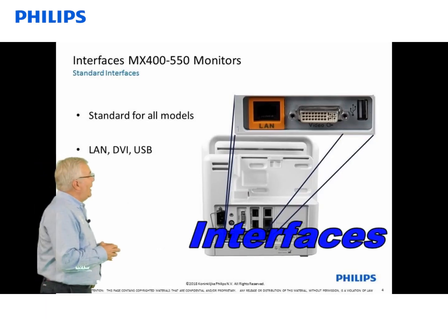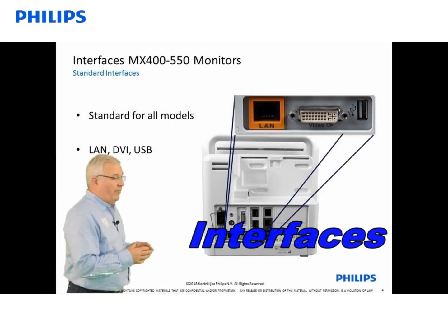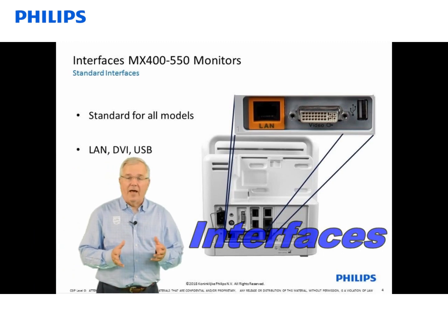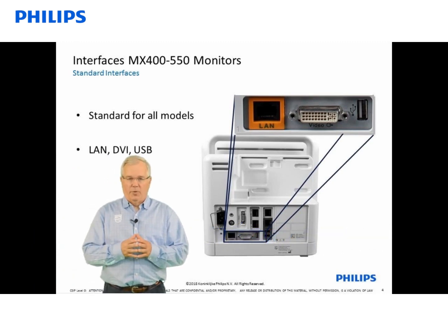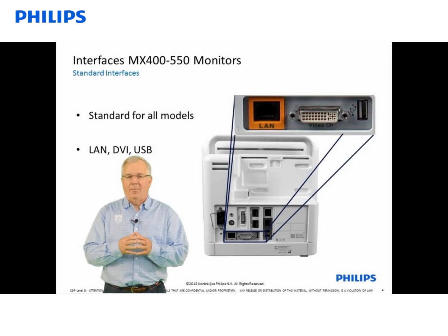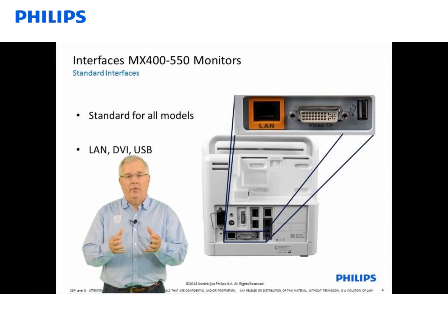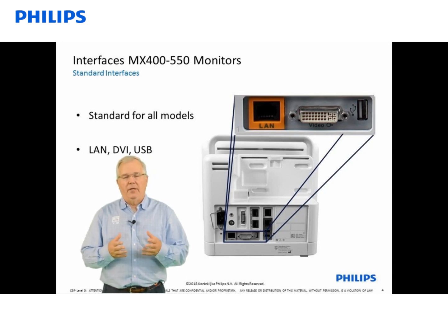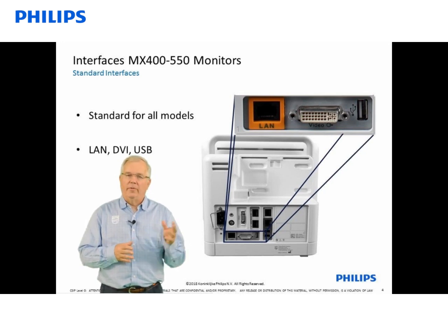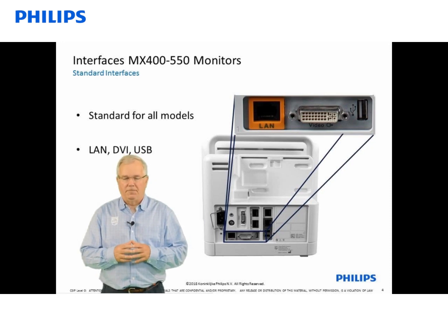Let's take a look at the back of an MX400 to 550 patient monitor with a standard interface board. The first thing you notice is that big orange LAN connector, or local area network connector. That's where we plug in our network cable, and by plugging in the network cable, that's what sends the information to the surveillance station.